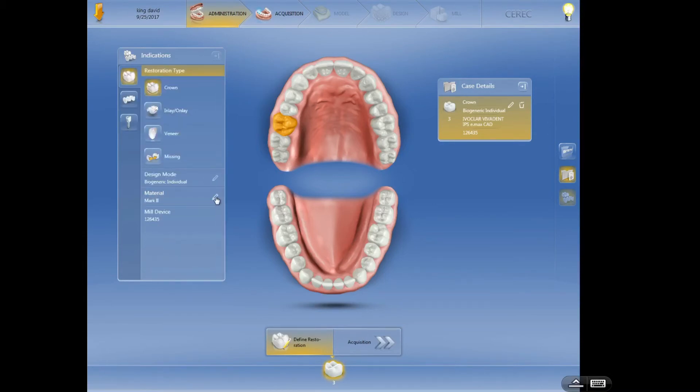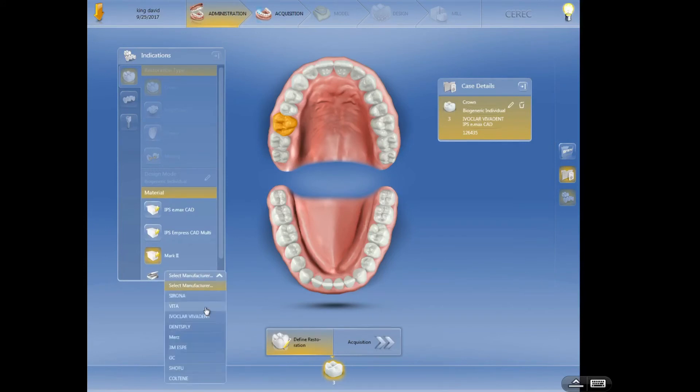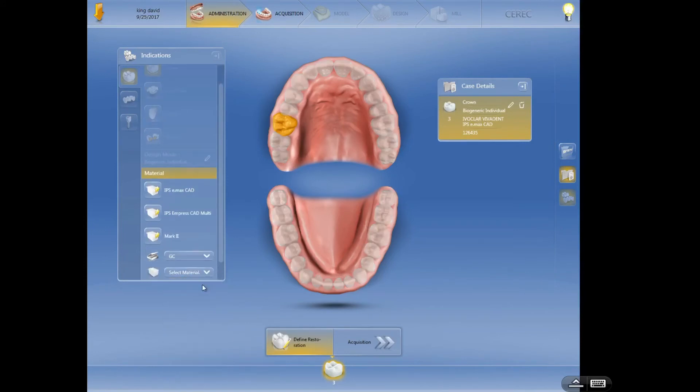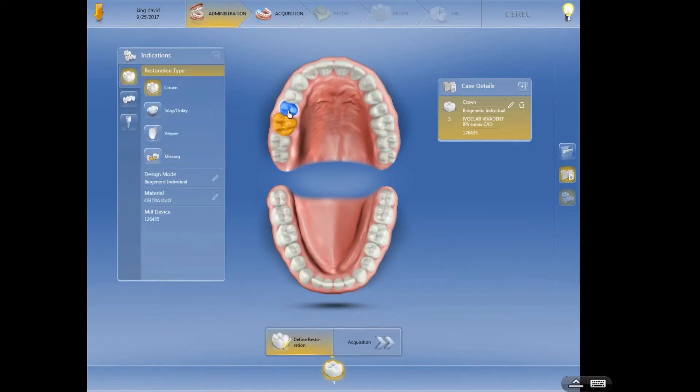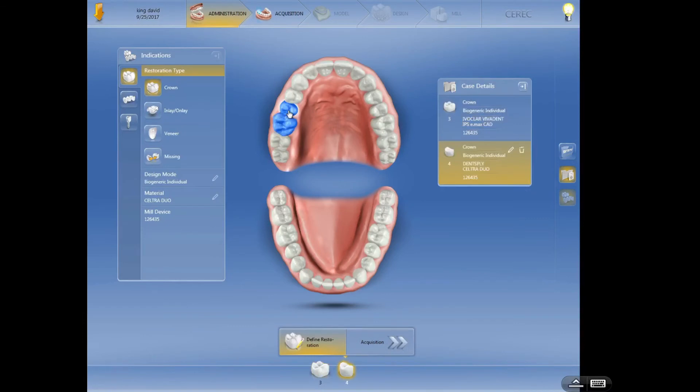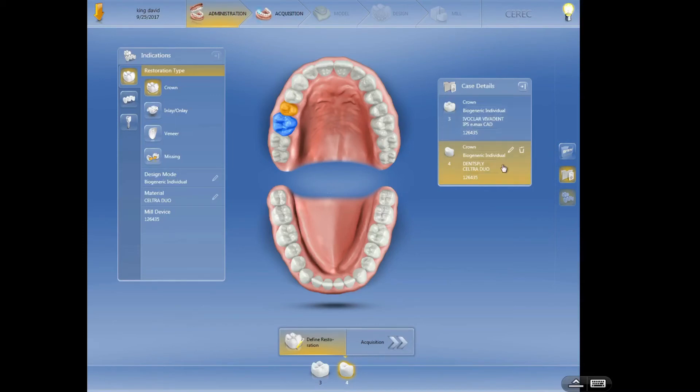Let's just say I wanted to use a Celtra Duo, which is Dentsply, and then select tooth number four. Now you can see we have tooth number three, which is a crown, biogeneric individual using Emacs, tooth number four, which is a crown, biogeneric individual, which is Celtra Duo. So you can see two different choices here.